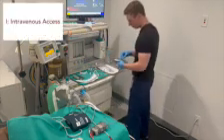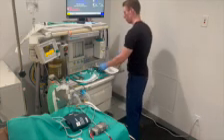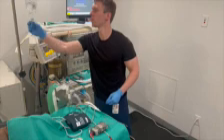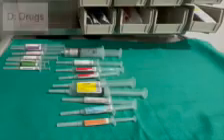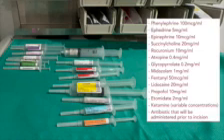The I stands for intravenous access. It will be important to always have supplies available to replace or add another IV. It's also important to know that you have blood tubing available in the event blood is needed. D stands for drugs. The following is a list of medications and their respective concentrations that need to be easily accessible. These include both the emergency and induction medications.